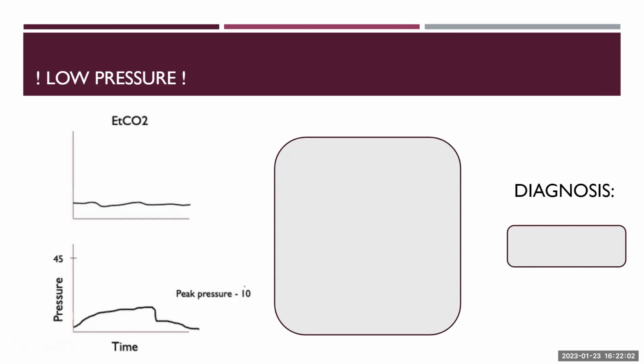It looks lower and more of a straight line than what you would expect. Yeah, so it looks a little funky. So now I'm concerned whether the CO2 is actually getting monitored correctly. There's something going on with the CO2. So then, looking at this pressure waveform, does this look normal or does this look funky?